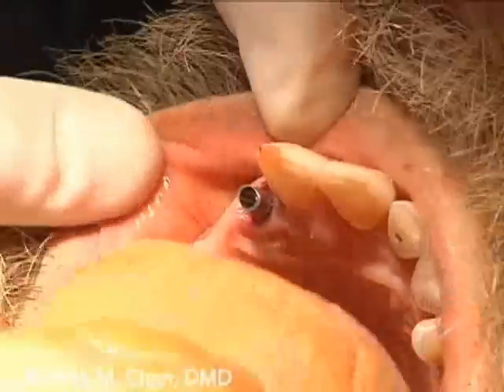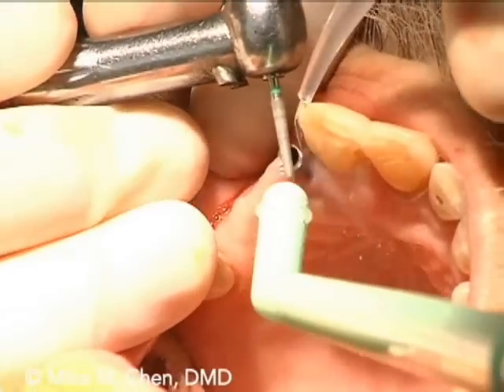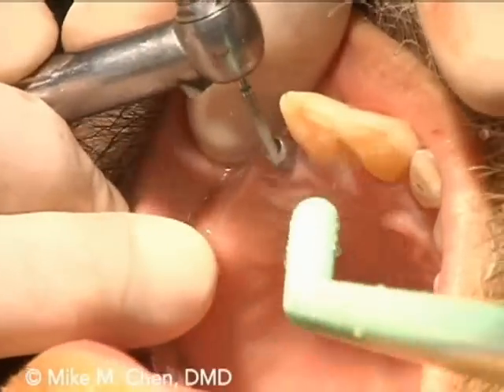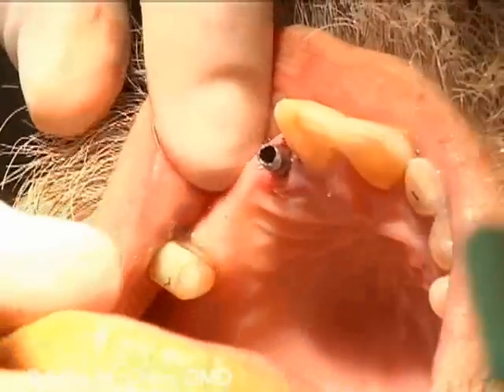Most times after the placement, you want to check the occlusion. If it's minor adjustment, you can do it right in the mouth. If it's major adjustment, you should do it outside the mouth. Of course, use a lot of water because it tends to heat up. If it does heat up, the temperature can go down to the implant and cook the bone, which we do not want.